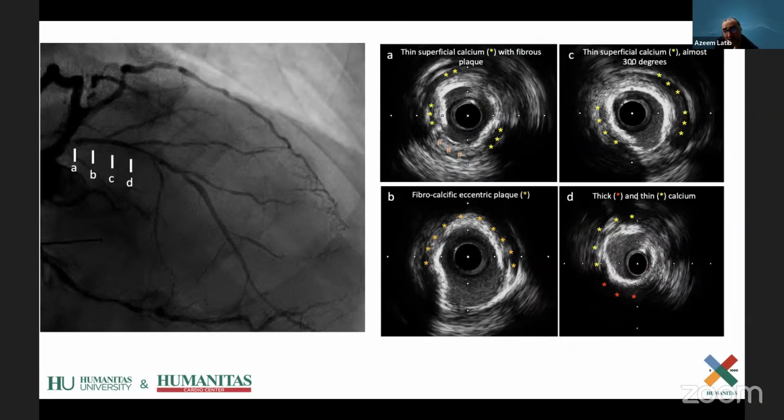Number one, it's tighter, so the burr is actually going to interact with calcium for a longer duration in the artery. And so the risk of distal embolization is what Antonio is concerned about, even though the EF is normal. Because when you have patients who are frail or have severe pulmonary hypertension or even moderate AS, and they get distal embolization, those are patients who can really deteriorate very quickly.